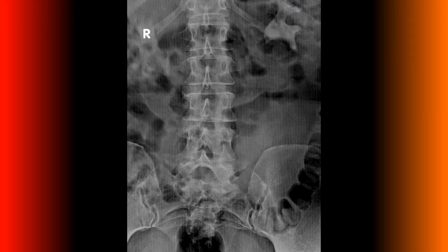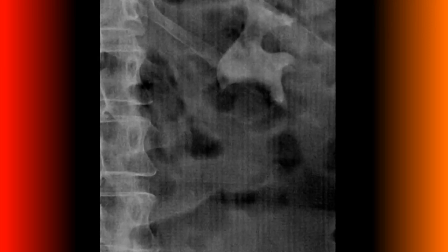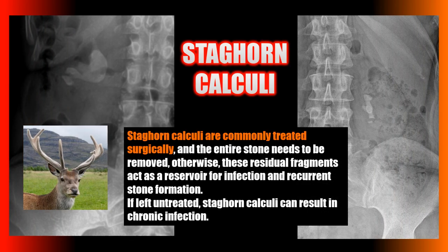Here is a frontal lumbar radiograph with a large calcific density in the left middle abdomen. This is a good example of a staghorn calculus — a renal calculus that obtains its characteristic shape by forming a cast of the renal pelvis and calyces, extending into at least two calyces. Staghorn calculi are commonly treated surgically; the entire stone must be removed, otherwise residual fragments act as a reservoir for infection and recurrent stone formation.